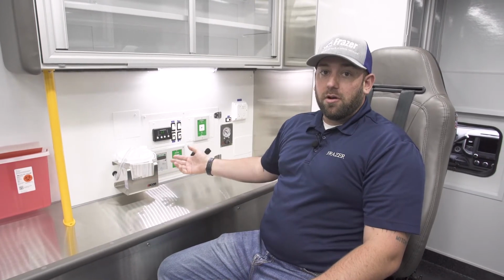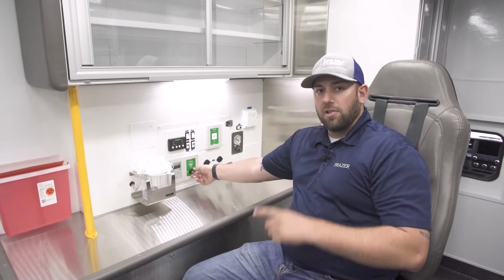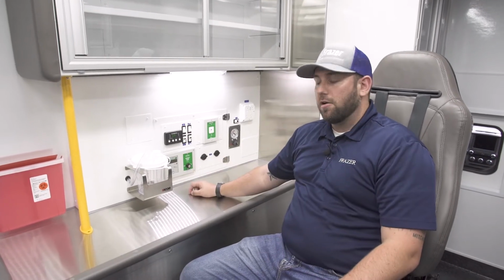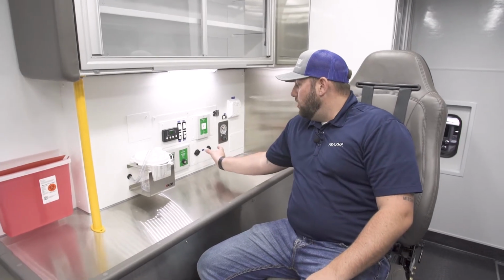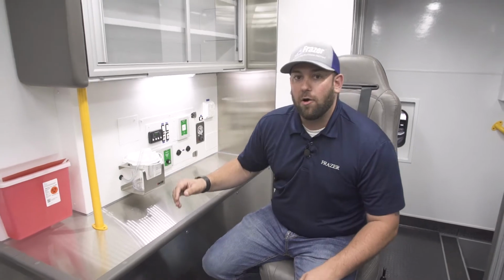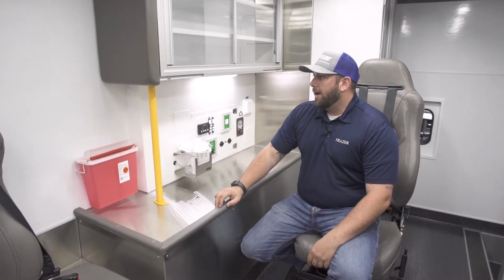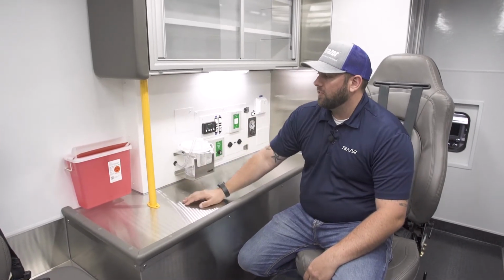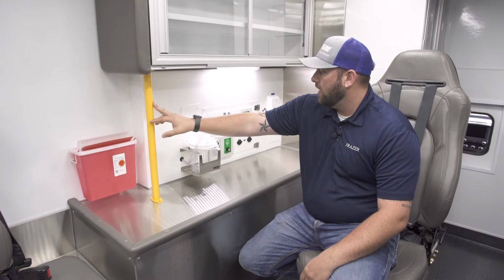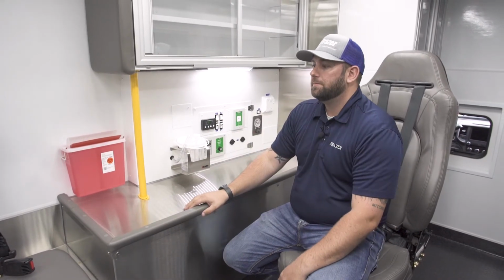Now, in case there's ever a failure of this system, you can emergency bypass it to allow a straight flow of oxygen from the bottle. So it does have that redundancy built into it. USB charging is becoming more of a common thing. People are charging with USB power instead of the 12 volt or even the 120 volt power. This is an IV pole connected from the action wall to the bottom of the cabinet, so you can put IV pumps here, plug into your 120 volt, and run to your patient.